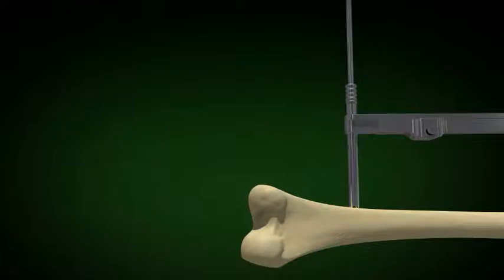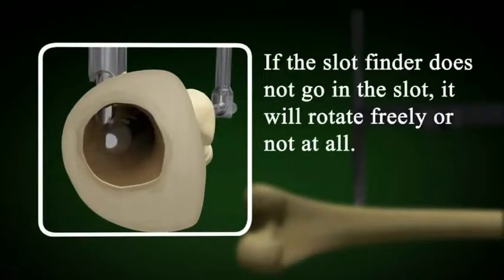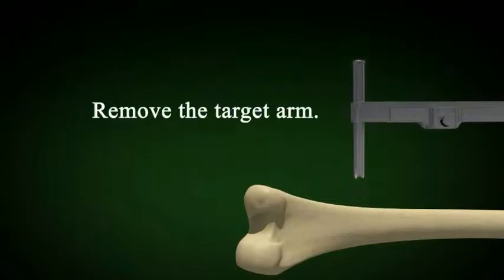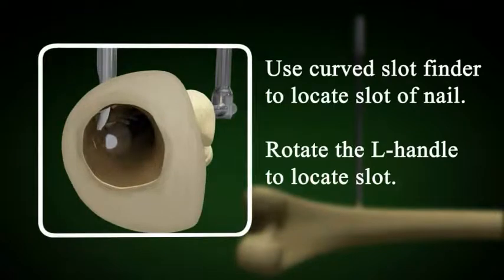Use the solid slot finder to locate the slot in the nail. If the solid slot finder does not go into the slot, it will rotate freely, or it won't rotate at all if it's stuck in the hole. Remove the target arm and use the curved slot finder to locate the slot in the nail. This will be a very important tool for you.